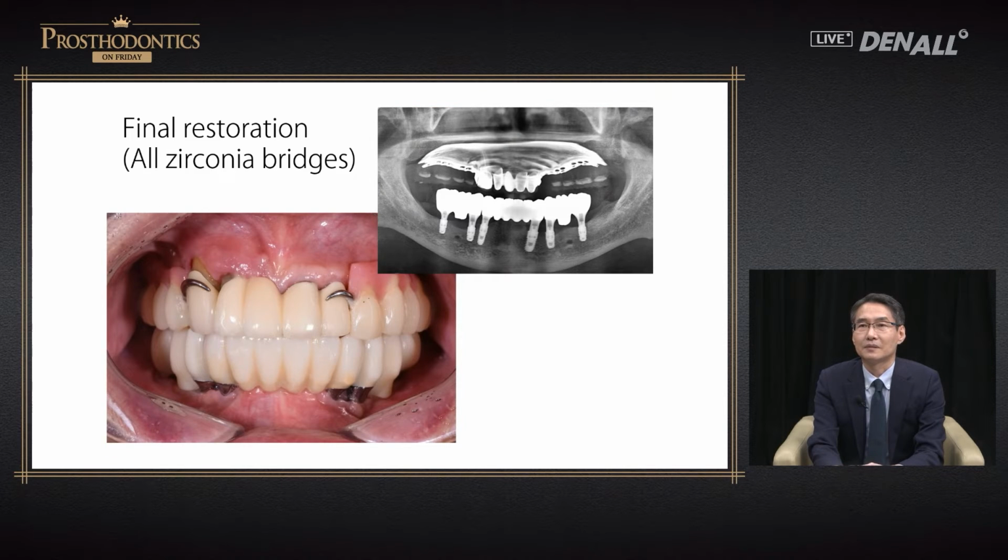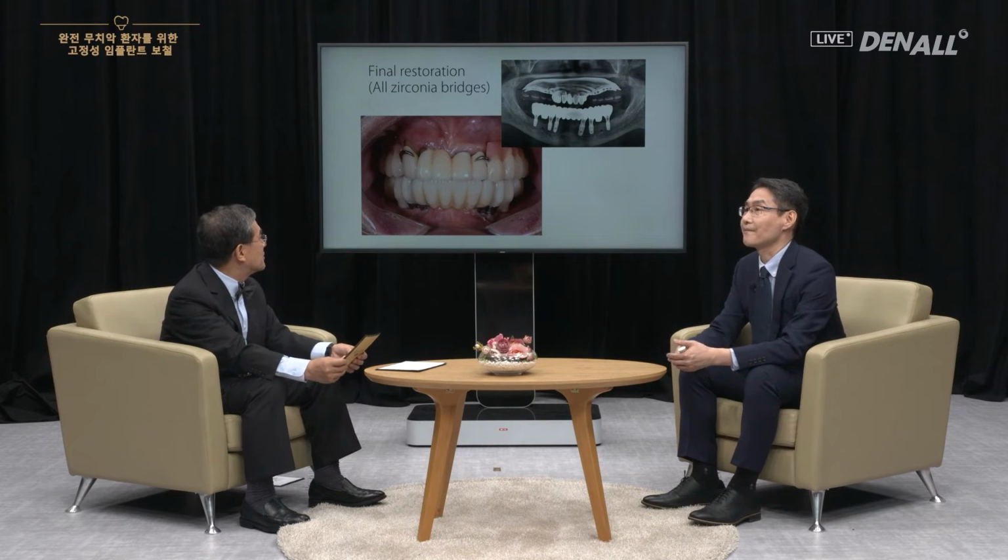Using this abutment, the final zirconia prosthesis was fabricated. There were 6 implants, so segmenting was done. In 3, yes. I segmented in posterior to canine. The lower is now complete.